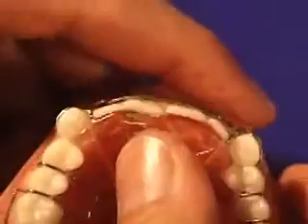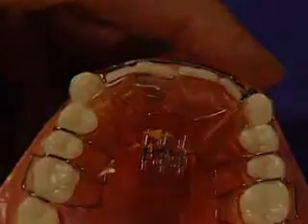When this happens, just turn the screw back and most of the time the appliance will fit back into place.